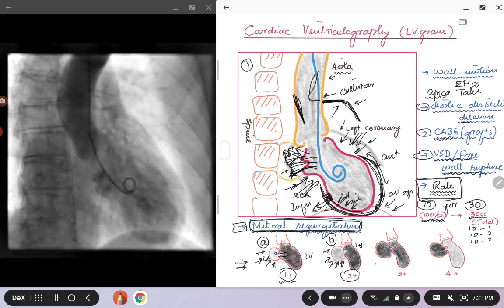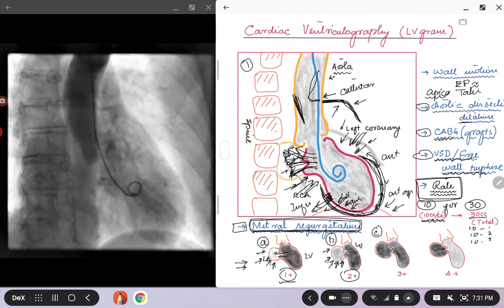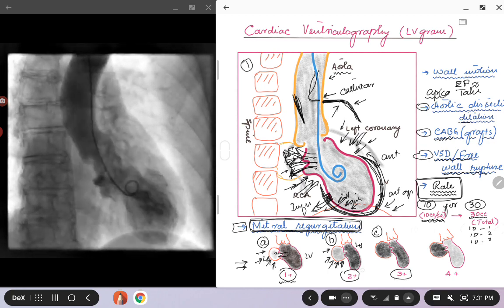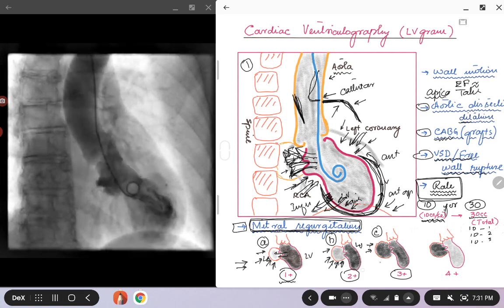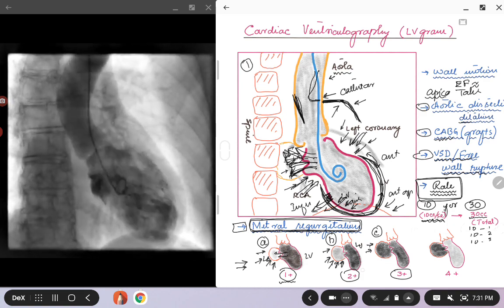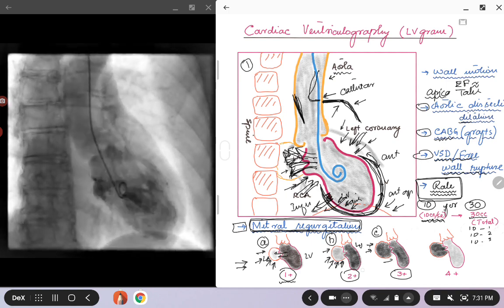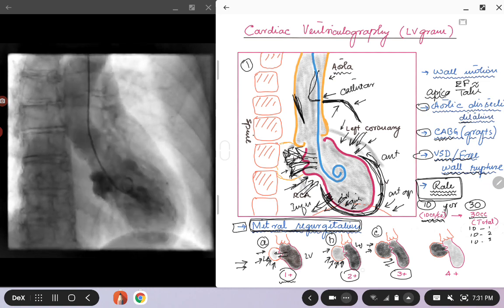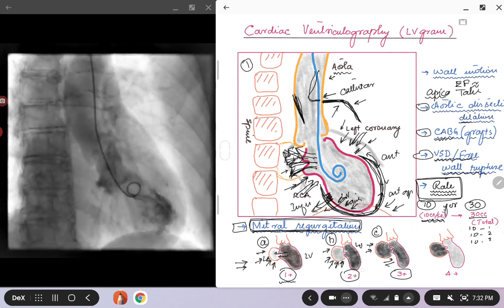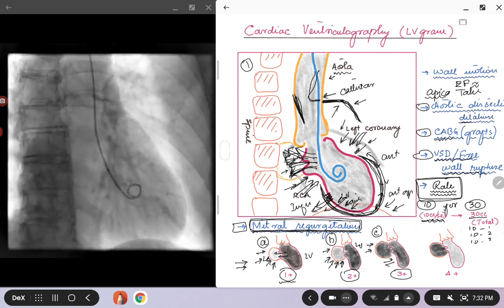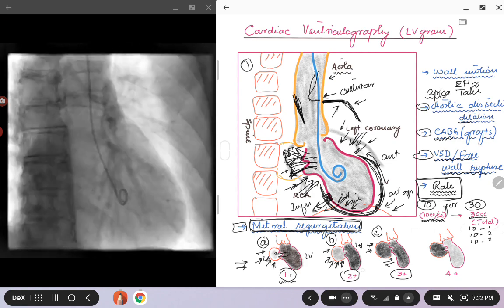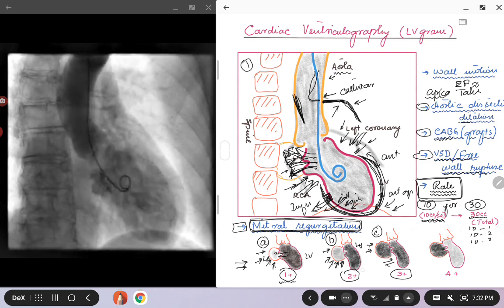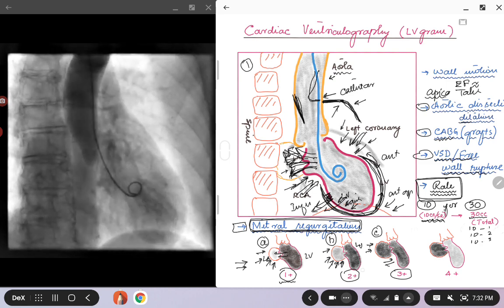Now we come to more severe mitral regurgitation. In picture C, for 3+ MR, you will obviously have left atrial enlargement, and during the cardiac cycle — after one, two, or three beats — there will come a point when the left ventricular opacification is the same as the left atrial opacification. Both the left ventricle and the left atrium will have the same intensity of contrast at some point, and you will eventually see the dye wash out.